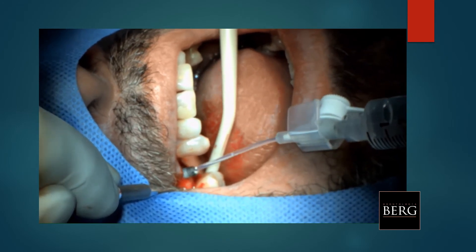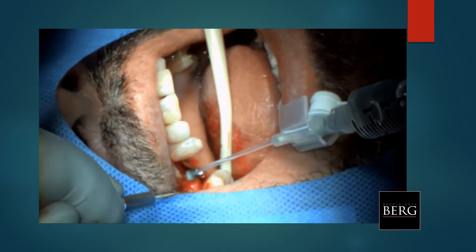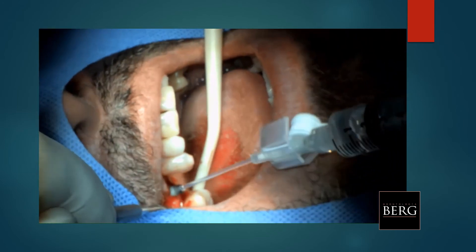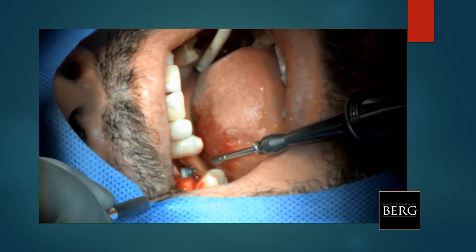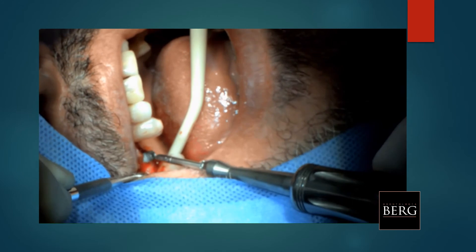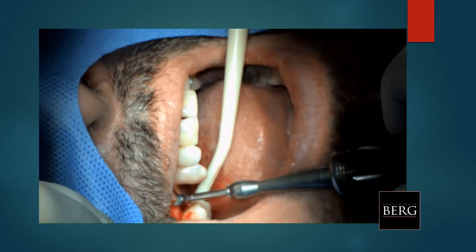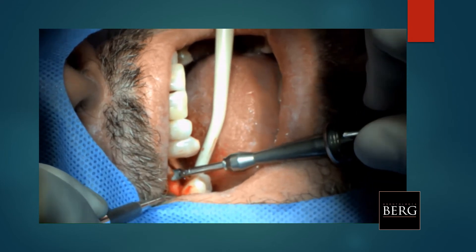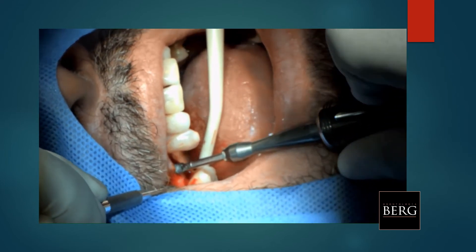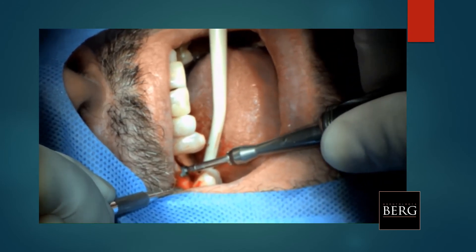As long as saline comes back, your membrane is fine. That is very easy to observe while performing surgery. Watch the saline — in a pulsating manner, saline comes back, and that is what we expect. You can see when the patient breathes, the saline comes back, which means we're in the sinus, we have displaced the membrane correctly, and everything is on its way.